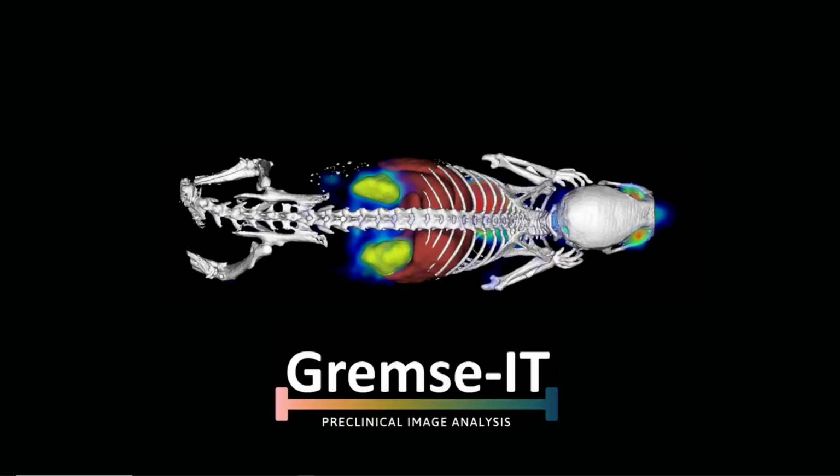Welcome! In this video I would like to speak about the advantages of saving your image data as a project file in our Imalytics Preclinical software.